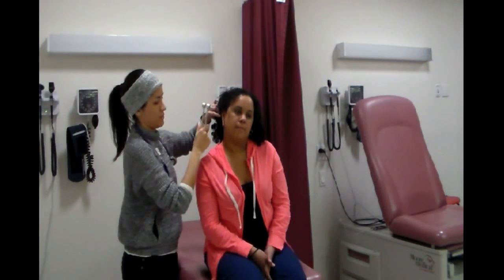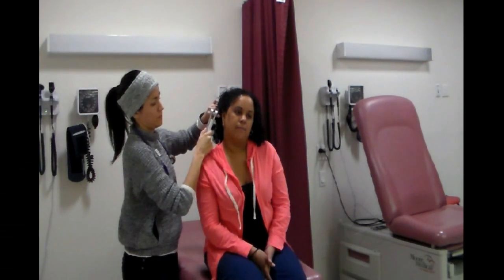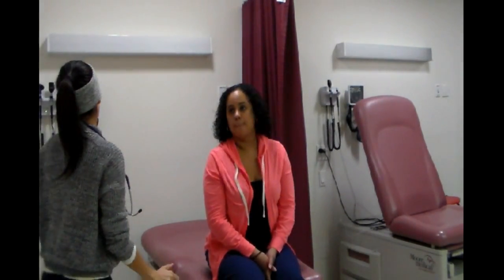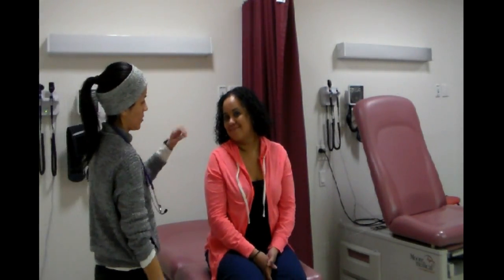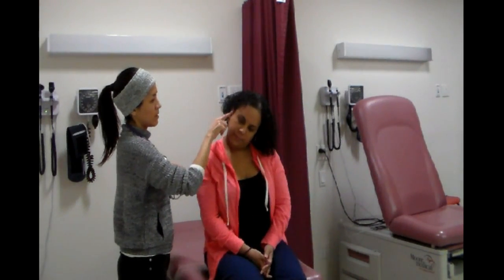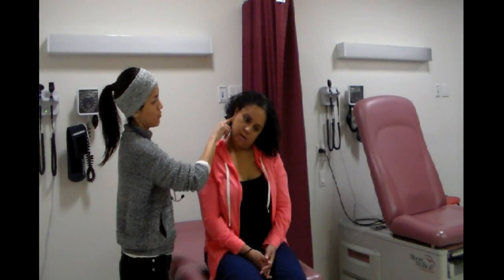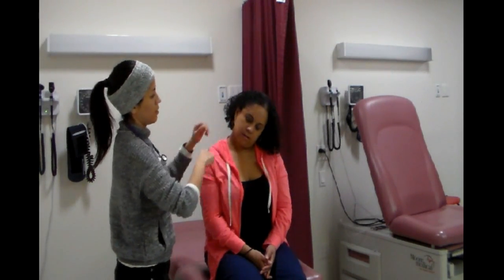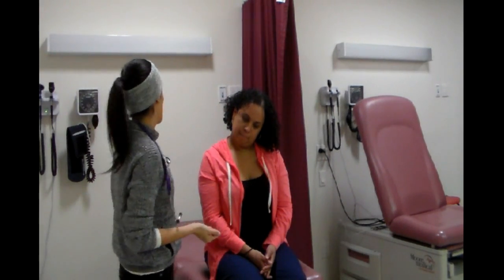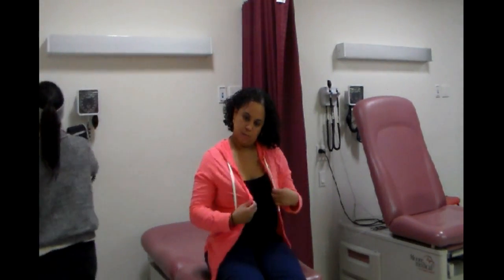Stop. Stop. Okay, so that is the Rinne test. Now I'm gonna look at your ears. I'm going to press on the tragus. Tell me if you feel any tenderness or pain, or at the mastoid. No pain. Okay, good. And the ear looks normal. There's no redness, no swelling, no signs of anything going on.